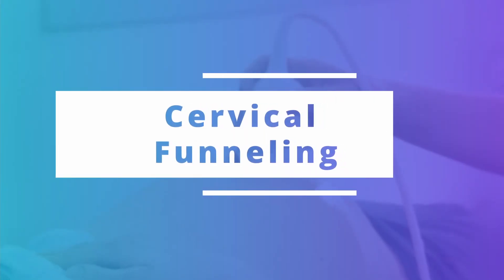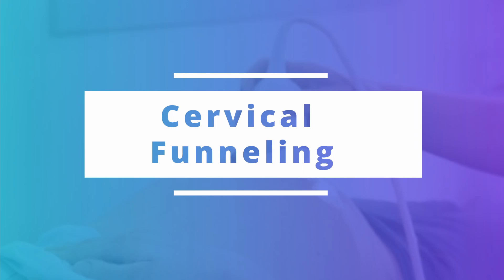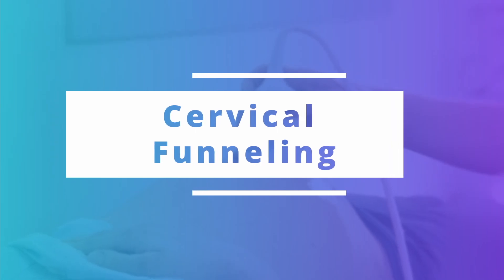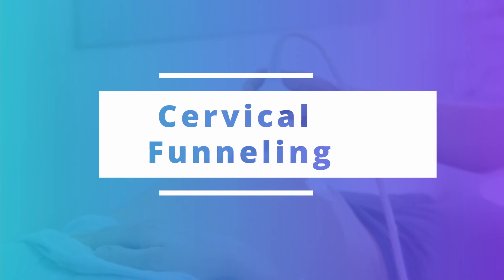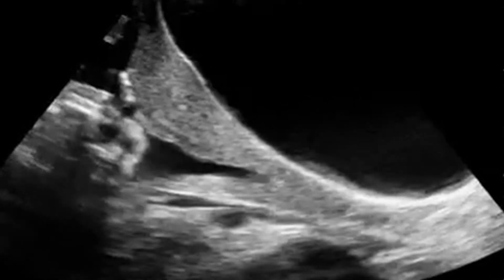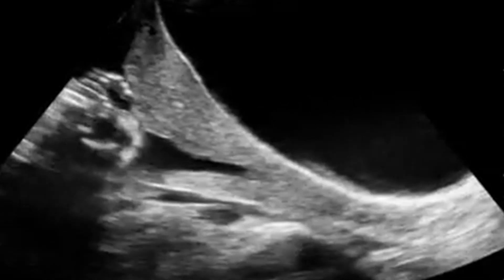In this presentation I am going to discuss one of the complications of pregnancy which is called a threatening miscarriage. A threatening miscarriage can have different signs. In this particular context I am going to discuss one of the signs that I saw as I was doing this ultrasound scan. The condition I am going to discuss is what is called cervical funneling.